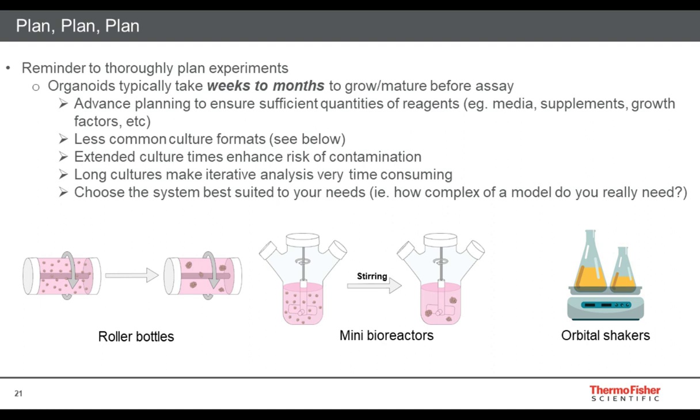And when you're investing the amount of time it takes to grow an organoid, for example, to a useful endpoint, and considering the investment of resources needed to grow these models, contamination is something that one should take extremely seriously, and really maybe take extra precautions to guard against, because if you go 3 months into a protocol and it gets contaminated, you kind of have to start over. So it's definitely something to keep on top of mind.